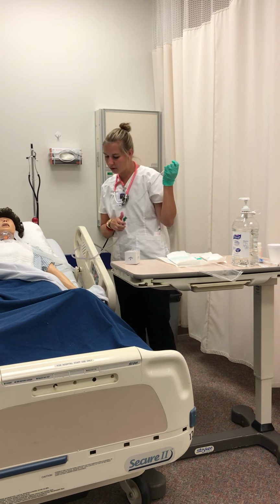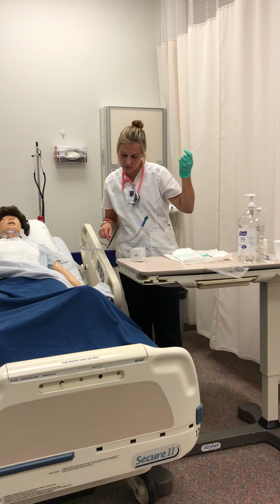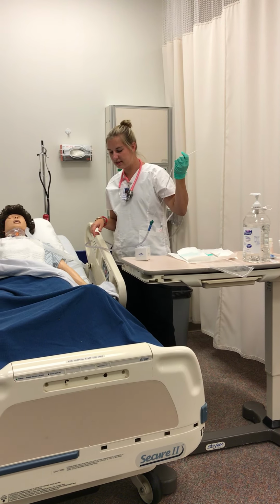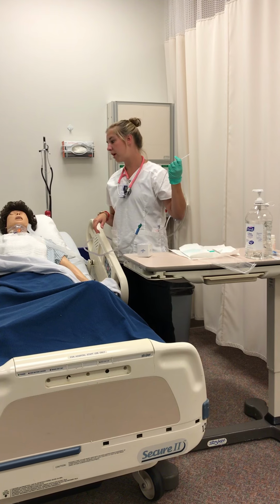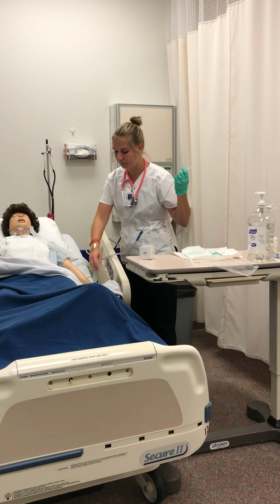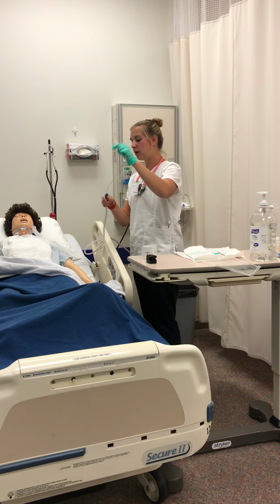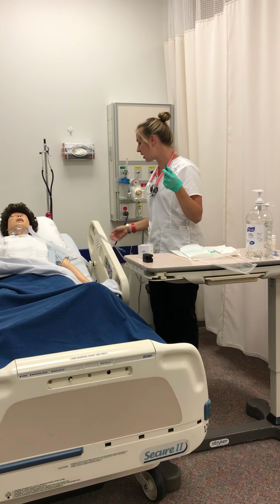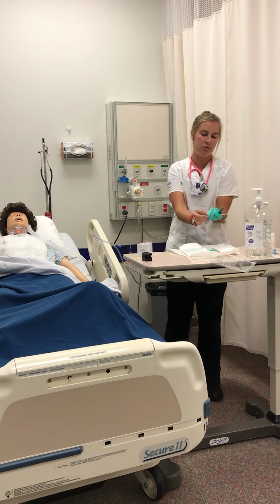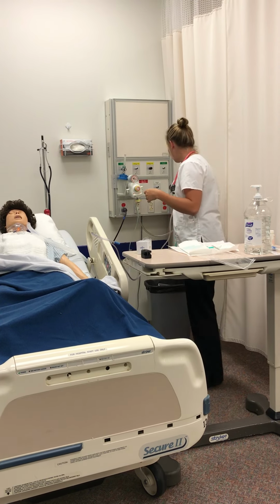I'm going to check her pulse ox. Her pulse ox is now 98, which is in the range that we typically like to see, and her rattling has seemed to go away. I'm going to detach the suction away from the catheter and remove my glove with the catheter inside of it and throw away.